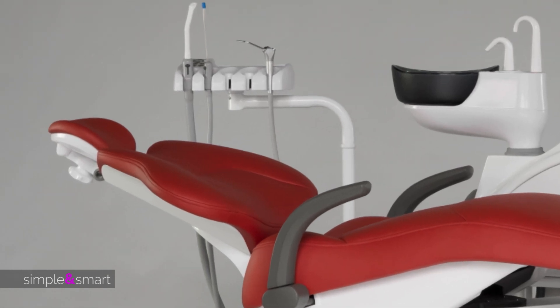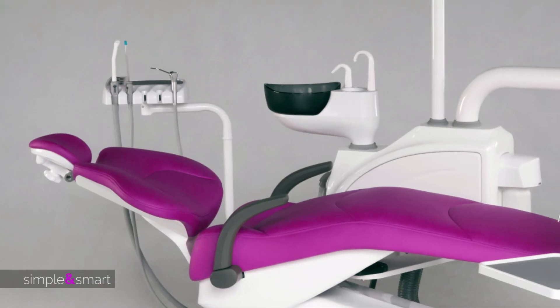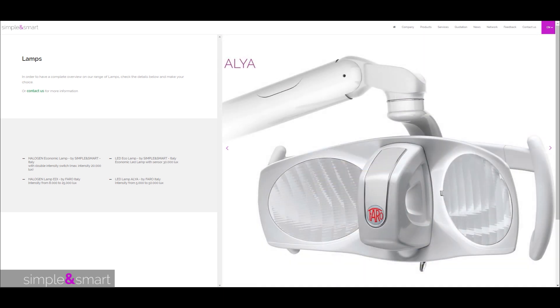Both dental units can be customized with the options you like. You can start from the standard configuration and apply many different things according to your needs, such as five different lamps, from the basic to the top version LED with 50,000 lux.